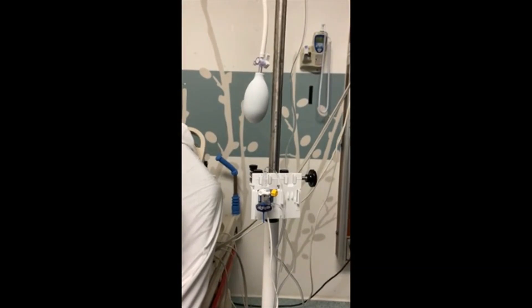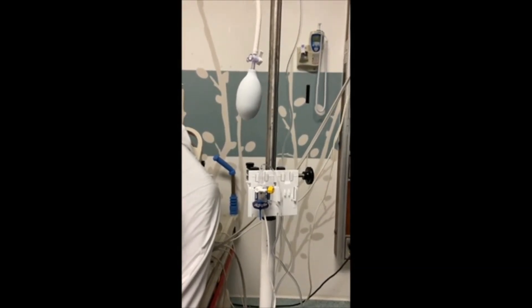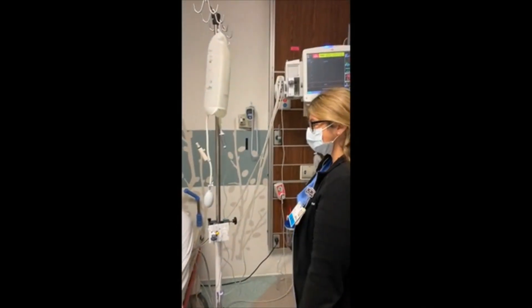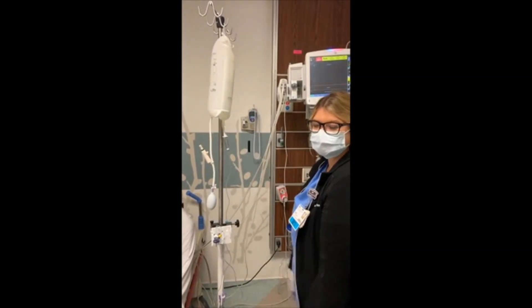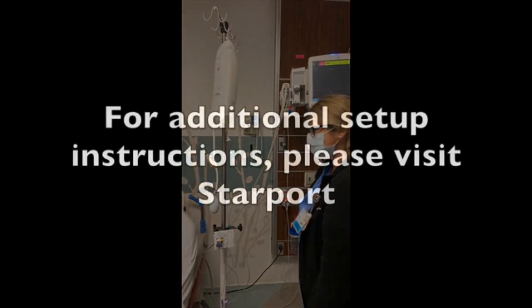Attach the setup to the patient. You should see a waveform on the monitor. The entire A-line pressure setup can be completed and ready to go before arterial line insertion. This has been an instructional video on A-line setup for emergency department nurses.